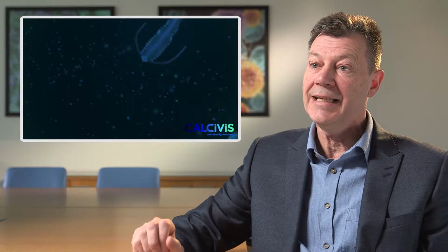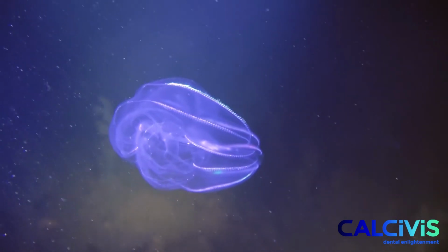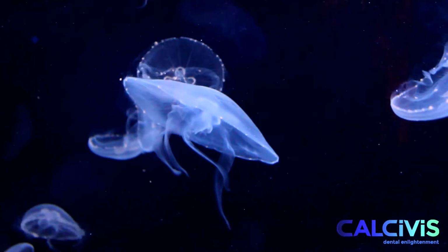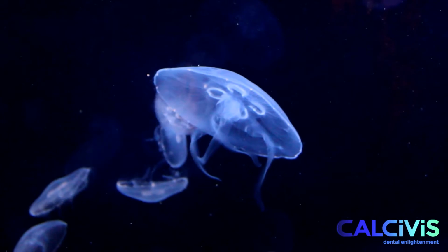To understand the relationship between bioluminescence and preventive dentistry, we first have to explore what bioluminescence is. It's a naturally occurring phenomenon, and quite often we see this in marine organisms, where they produce tiny flashes of light. The way this works is with photoproteins. The organisms have photoproteins which react very specifically with calcium ions, and when they have this reaction they give a tiny burst of light, and that's what we see in nature.